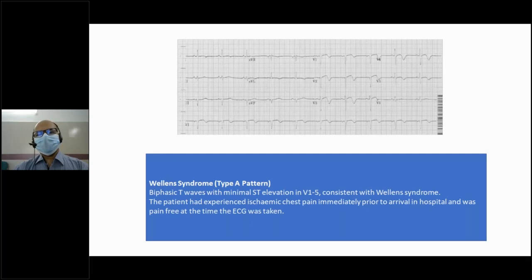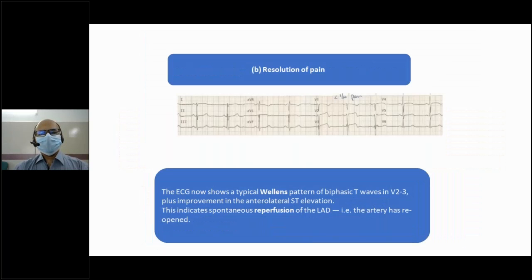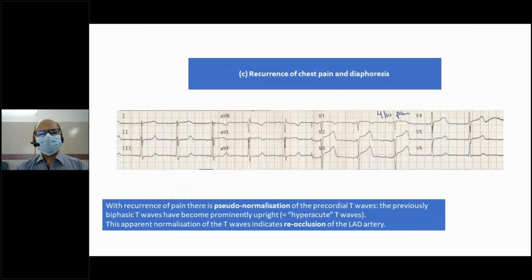This is another ST depression, ischemia. Basically, this is myocardial ischemia, not infarction. ECG diagnosis is myocardial ischemia, but ECG does not always indicate myocardial necrosis, but when the patient shows positive cardiac biomarker, it is labeled as myocardial infarction, ST elevated or non-ST elevated. This is ST segment elevated myocardial infarction. Okay, so a lot of ECGs.